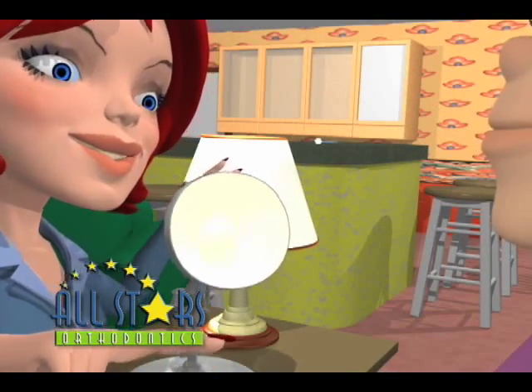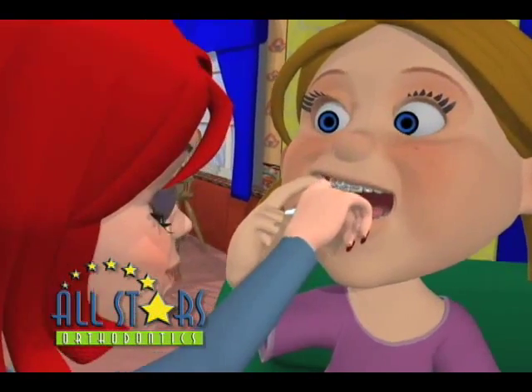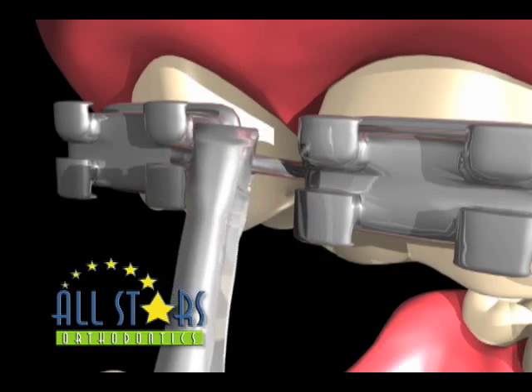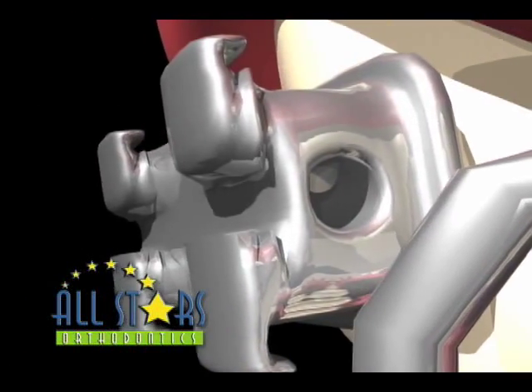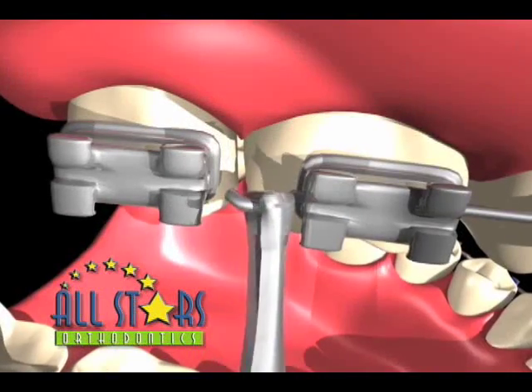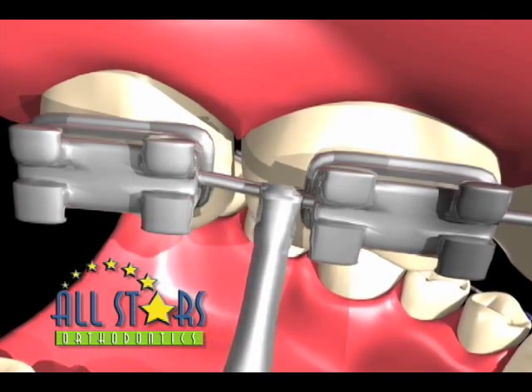Position a light so you can get a good look at the wire. Using tweezers, grab the wire near its end so that only about two millimeters is sticking out. Flex the wire and insert it into the open end of the last brace. Remember, the last brace is just a hollow tube with nothing inside to hold the wire. Once the end of the wire is in place, you can use the tweezers to finish sliding the wire through the last brace until it's straight.